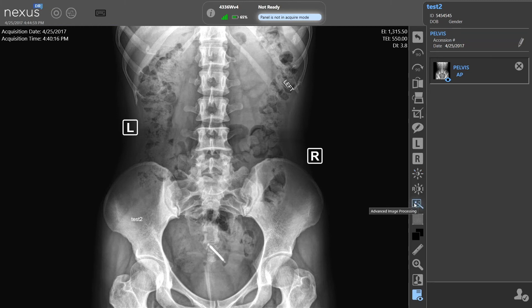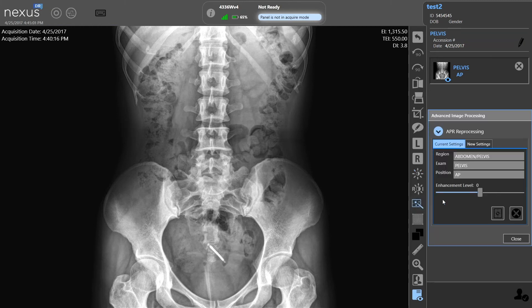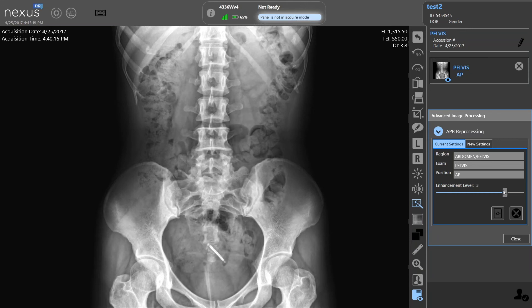Another feature is the advanced image processing tool. When you click on this, you'll see that you have enhancements that you can move either left or right. If you move to the left, you'll notice that the image begins to look a little smoother, and depending upon the way you like to see your image, this may be what you prefer. If you move to the right, you'll see that it makes the image a lot sharper. So this is a way for you to post-process and get an image to look more the way you want without a lot of extra maneuvering inside the settings of the software.